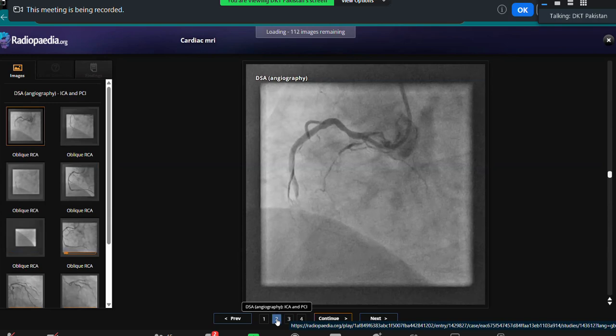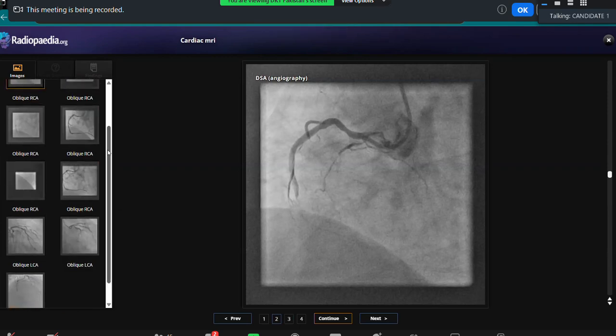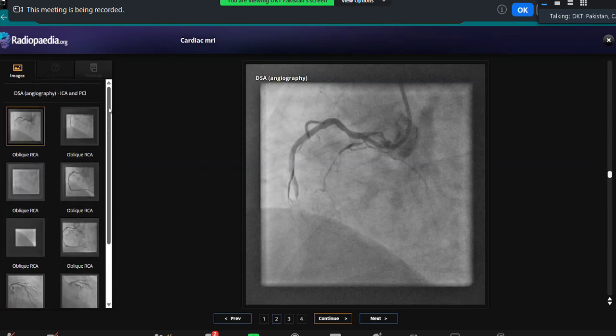Yes, so this is a good answer. Rather than saying that, can you see any myocardium there? No, sir. Only coronary arteries are visible on the coronary angiogram. So to confirm the diagnosis, they cannot confirm there is myocardial infarction on angiography. I said this is an emergency, so the patient needs to have an angiogram for therapeutic purpose. I mean that. You meant that, but you said something else.